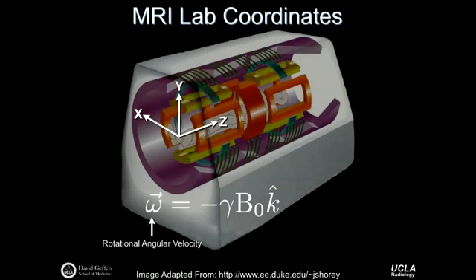Okay, so we saw this before. I didn't actually show you this exact figure of how we define the coordinate system for the MR scanner. I really should have drawn the origin here at isocenter, which would be positioned in the middle of the B1 coil, if you will. But we generally take the Z-axis as the head-foot direction, the X-axis as left-right, and the Y-axis as anterior-posterior.